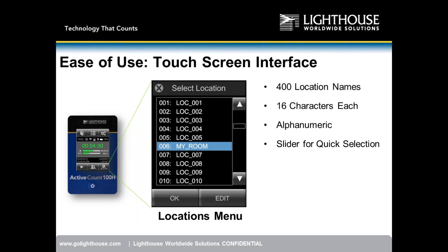The location menu — the map icon in the bottom right of the home screen — allows entry of up to 400 unique location names, each up to 16 characters long using a combination of letters and numbers, with a slider for quick selection. 400 location names, 16 characters long.